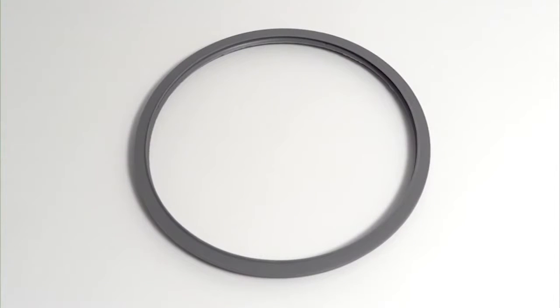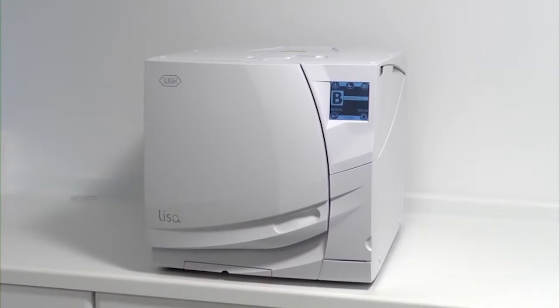The door seal is an integral component of your W&H Lisa steriliser and regular maintenance is necessary to ensure continued safe operation in line with the Pressure System Regulations Act 2000-128.